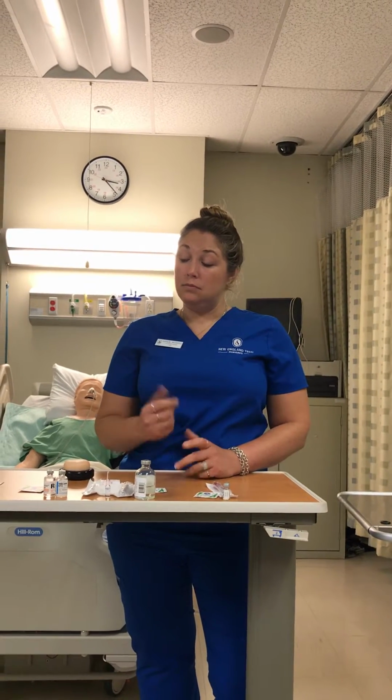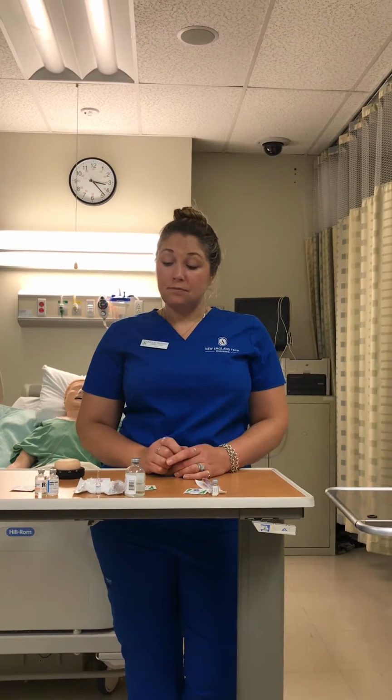An inhaler would also be a medication. Some people use a chamber. You would have them blow out their air, and then as they inhale, to push the button down, and then rinse their mouth out after they're done.